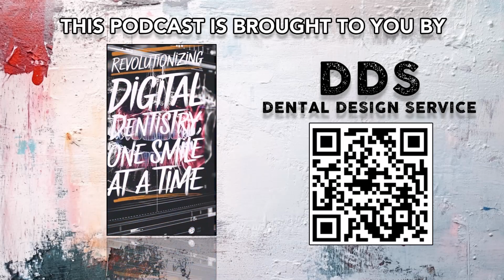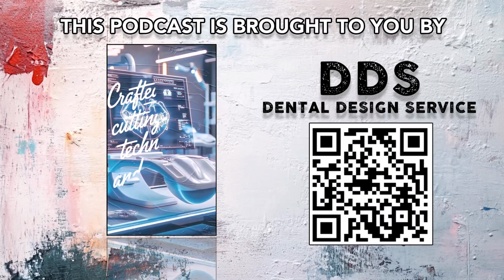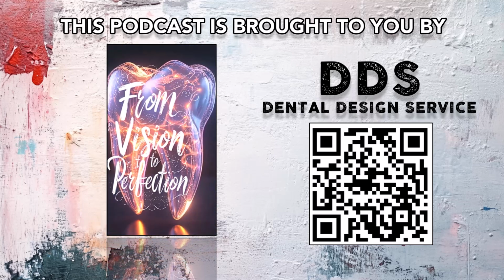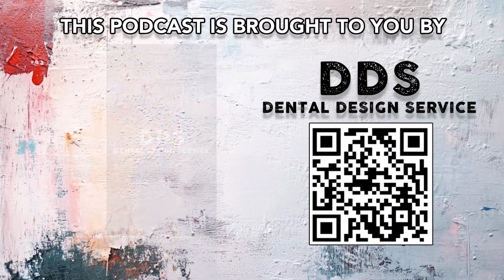Revolutionizing digital dentistry, one smile at a time. Crafted with cutting-edge technology and artistic precision. Turning concepts into lifelike restorations. Experience the future of dental design today.